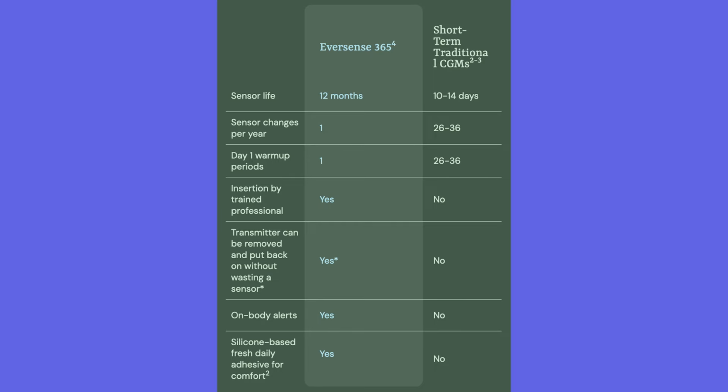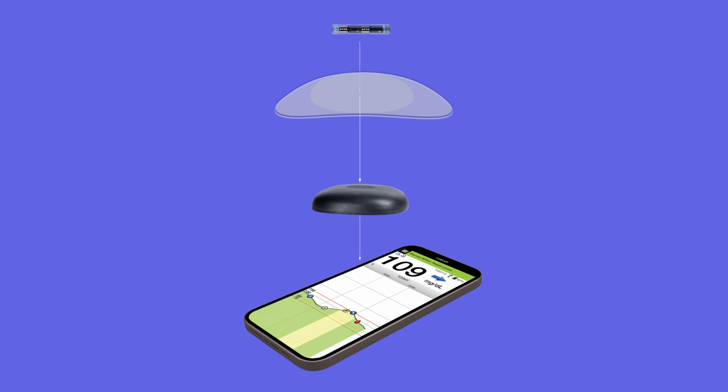What about the changes in calibrations? I know that calibrations were needed every day with the last sensor. How has that changed here? Yeah, so we talked about the chemistry change for stabilization in the body. The other big thing we were working on is to essentially give us more optics so we could look at different wavelengths of the spectral signal that was created over time. In the first generation, we only had one LED and 2 photodiodes. Well, we've now taken that up to 8 LEDs and 16 photodiodes. So a significant improvement with no size increase. So that was a key design element, right? So it stayed in the exact same shape, length, width, and dimension. But that has now given us an ability to look in different places, if you will.